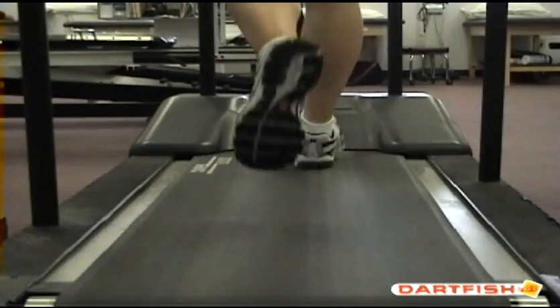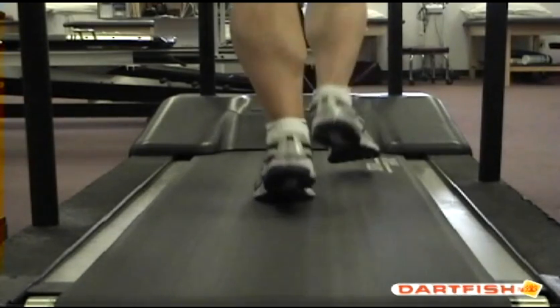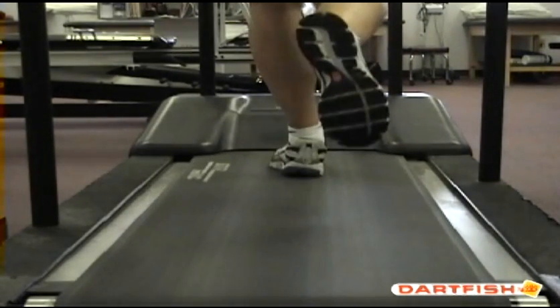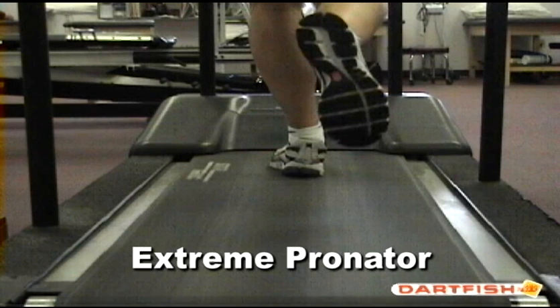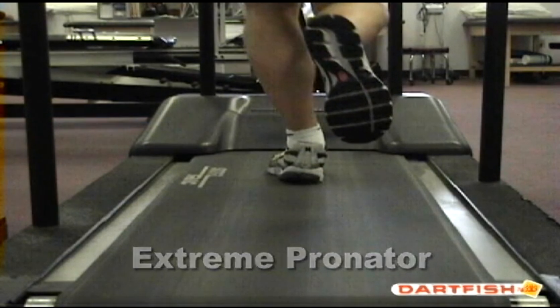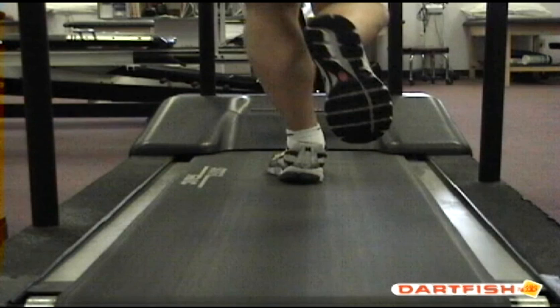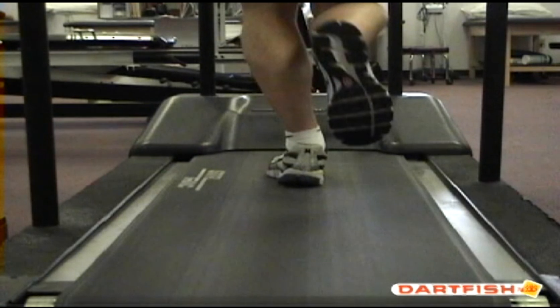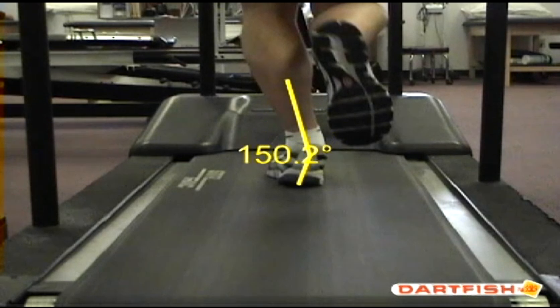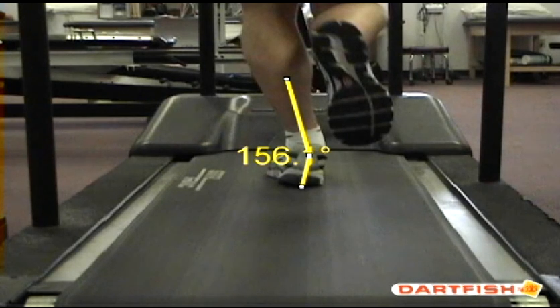To begin with, we will take a look at a few examples of runners being videotaped from a posterior view. The first video shows a good example of how Dartfish can capture what goes on at the foot and ankle. This is an example of an extreme pronator. Everyone pronates to some extent with normal gait mechanics. Typically, most people pronate from about 8 to 15 degrees of motion in the rear foot. As illustrated here, excessive pronation can lead to common injuries at the hip, knee, and ankle. As you can see, this is clearly excessive from the normal.